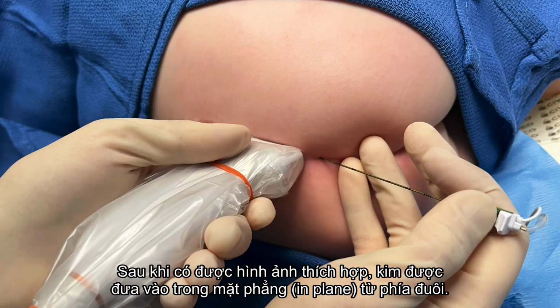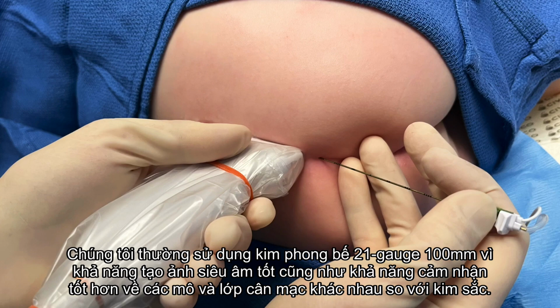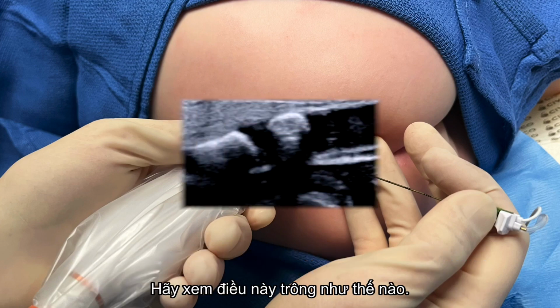Once you have the appropriate view, a needle is advanced in plane from the caudal aspect. Take care to stay shallow, as the hiatus is not very deep, especially in neonates. We typically use a 21 gauge 100 mm block needle for its echogenicity, as well as the enhanced appreciation for different tissue and fascial layers we get compared to a sharp needle.